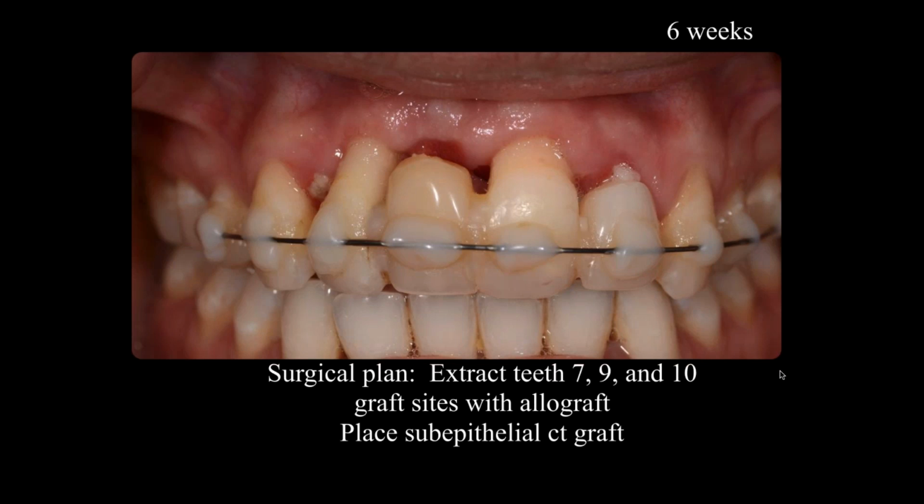And you can see now that everything is off the gingiva. Things are stable. You see he stabilized it back a few teeth. So she's actually quite stable like this. And she wants to know what's going to happen. So I said, we're going to let things just settle. We're going to see where you are.